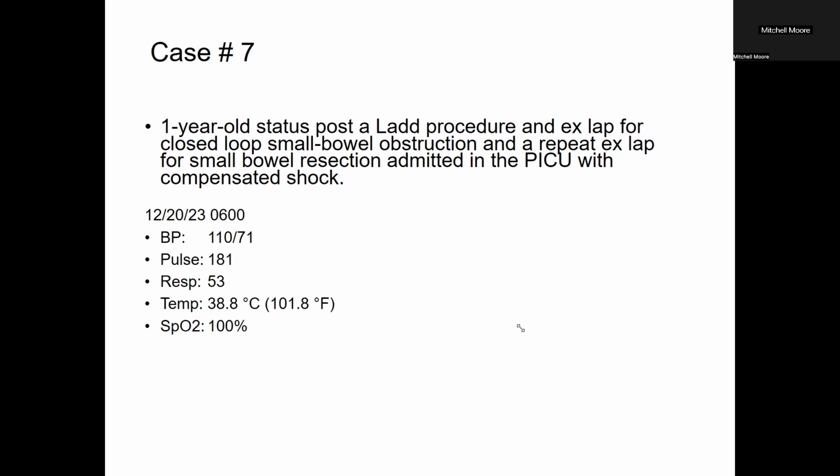And I can show you a cool trick at the bedside. You know how with those needles, you have this plastic guard that covers the needle. What I do is I measure out how deep the pleura is from the skin, and then I cut the guard and put it on the needle. So even if I wanted to, I cannot go in deeper than that. I see, that makes sense. So that's a way to make sure that you've not inadvertently gone in way more than you need to.